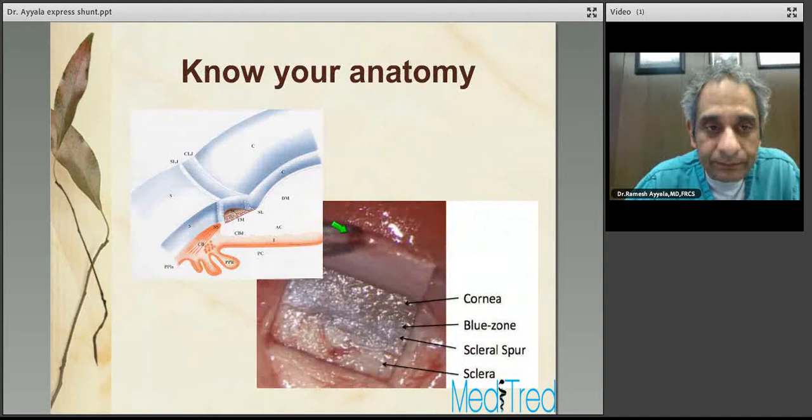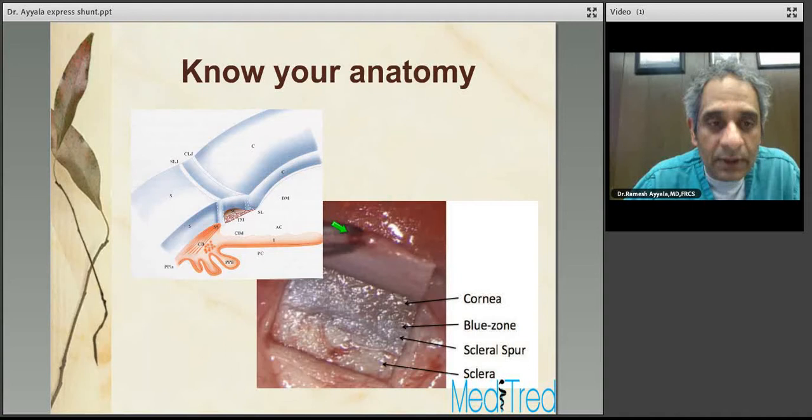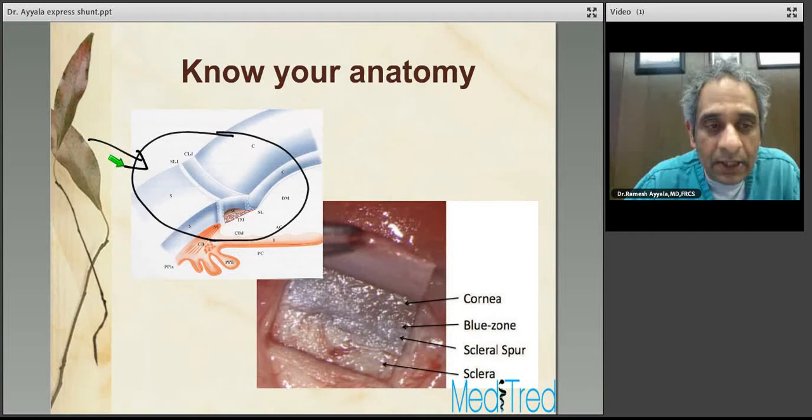Know your anatomy before you do any glaucoma surgery. In relation to Express, here is the relevant anatomy. As a surgeon looking down through the microscope, you can see the sclera, the scleral-limbal junction, the corneal-limbal junction, and the cornea. When you go past the scleral-limbal junction, which is where the scleral spur is, you will start looking into the blue zone.